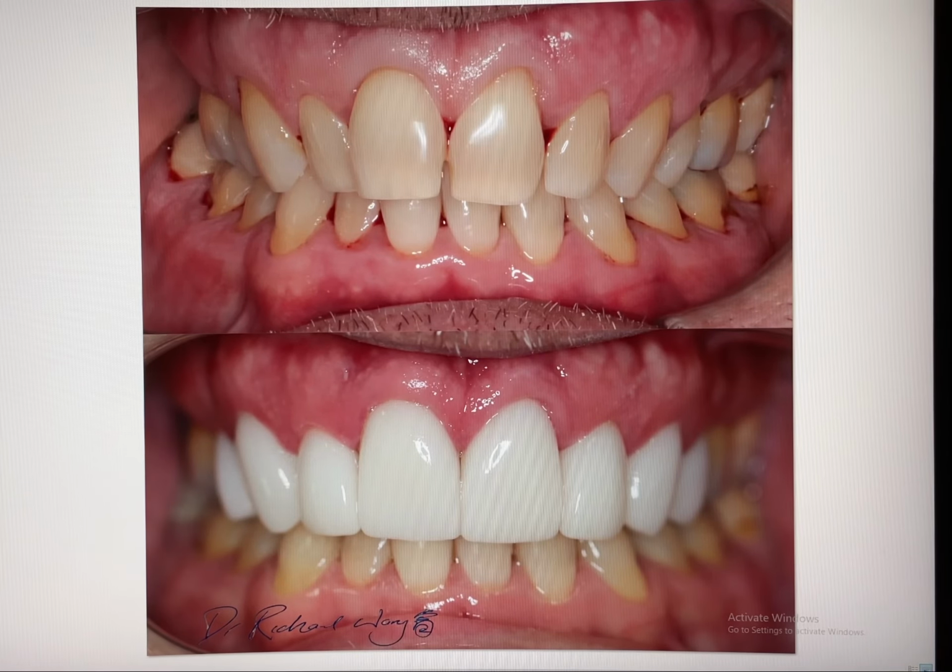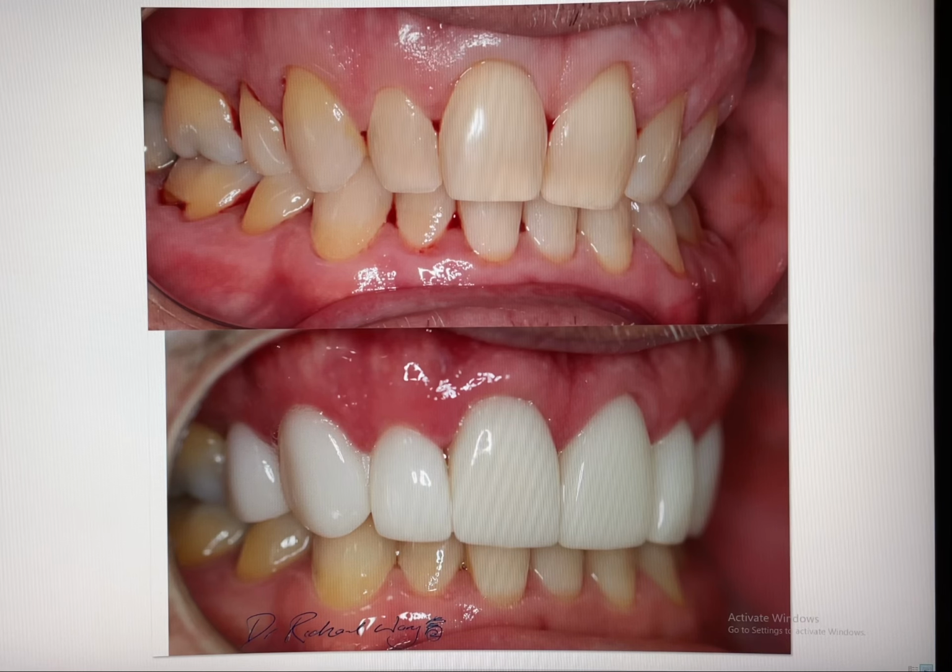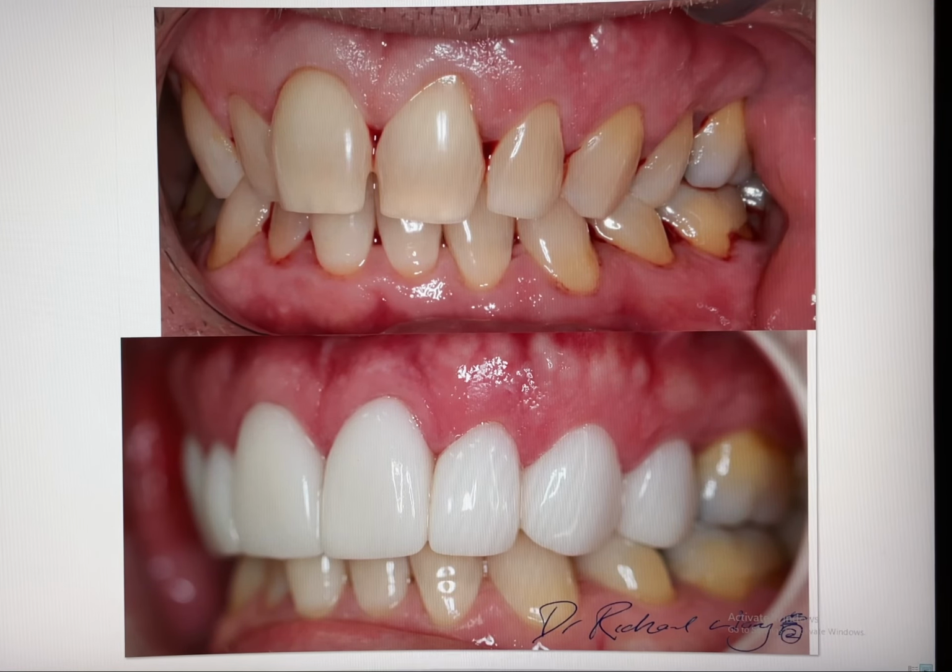We performed a smile design, smile preview satisfying his requests. Our patient was happy and gave me informed consent to deliver veneers. We delivered 8 porcelain, glass, ceramic veneers in total, closing the gaps between the teeth and achieving better alignment for the right hand side, front side tooth.